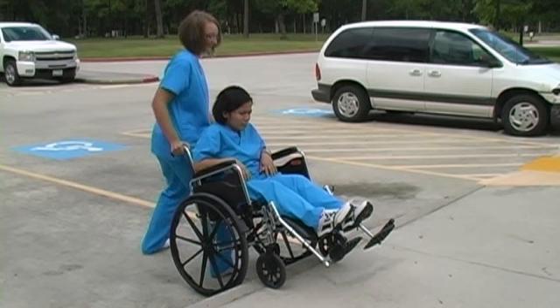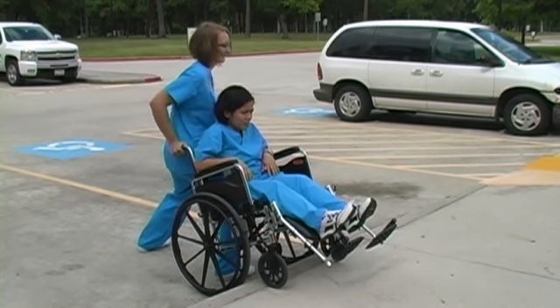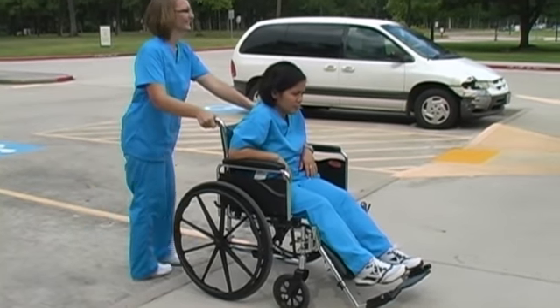Turn sideways and place your hip against the back of the wheelchair, bending your legs. Lift the handles while straining your legs and bring back wheels on the curb.